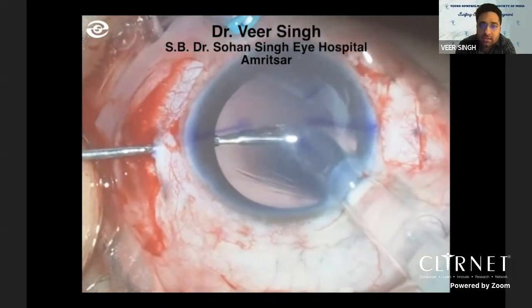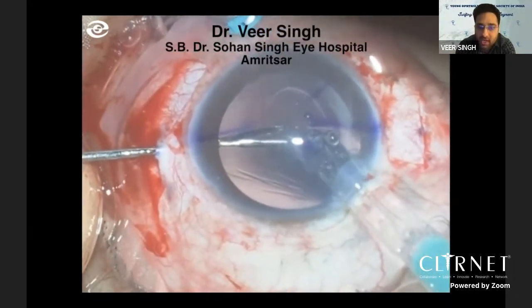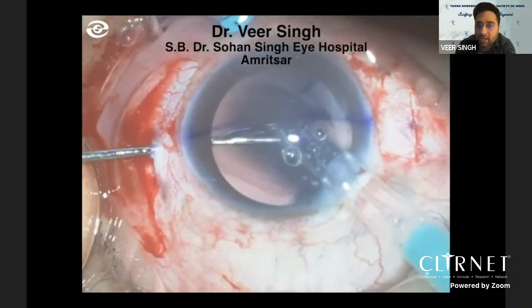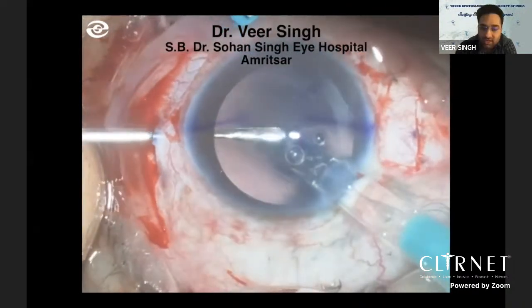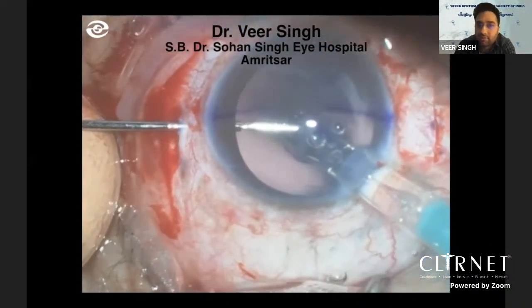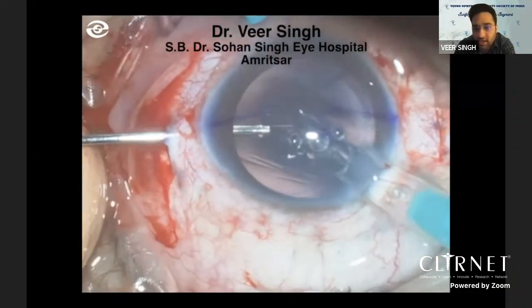And these are the dedicated forceps which are provided by Appasamy. This is the T-flex forceps. Here I'm going slow because viewing the T haptic is very important, and grasping it properly is important because there are some air bubbles. So I'm going slow here. You can either grasp the haptic from the side of the tip, or the center is usually better.